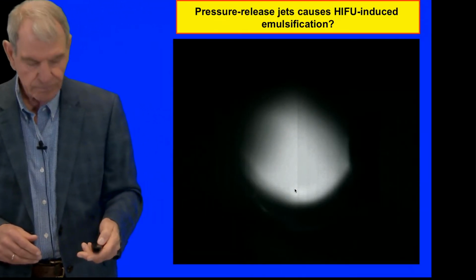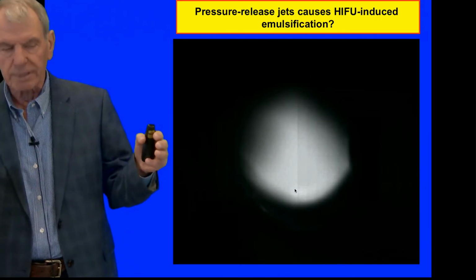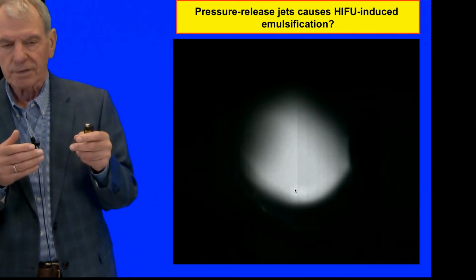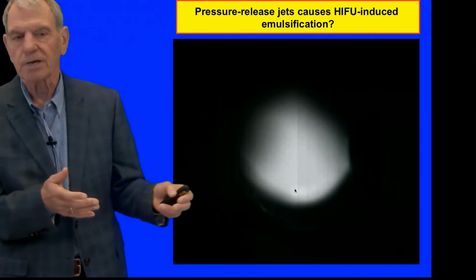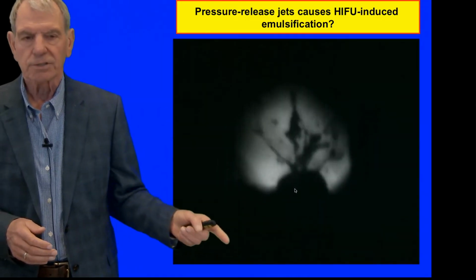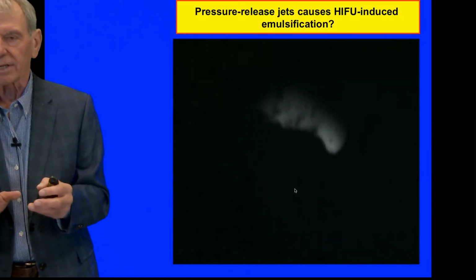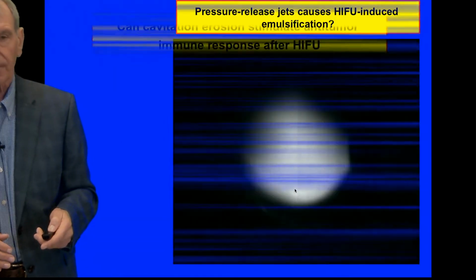Now, the hole is generated by a boiling bubble that lasts for several milliseconds, and if you have a megahertz frequency ultrasound, you have those cycles coming in while the hole is expanded, and what you get is a blowing of the tissue into the hole. So the reason these holes are generated from boiling is that you're blowing the tissue off the surface.